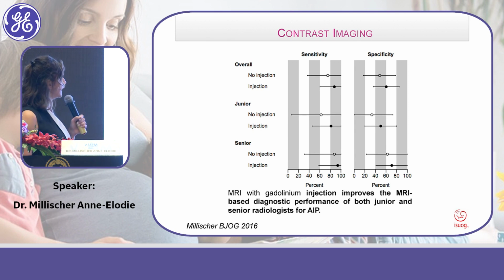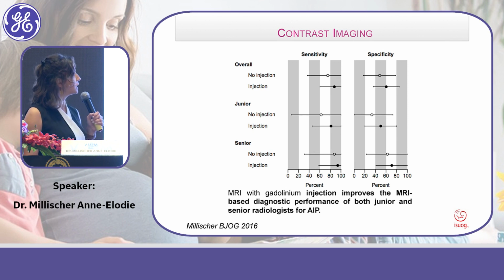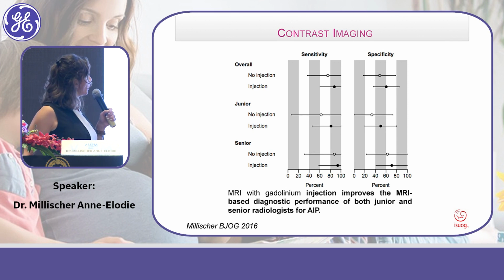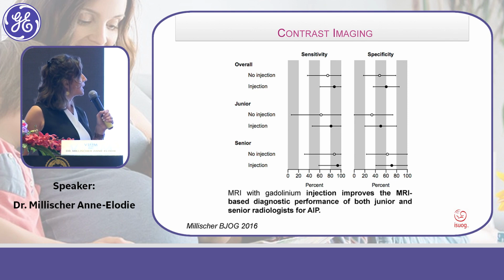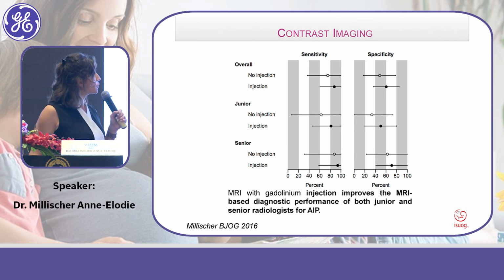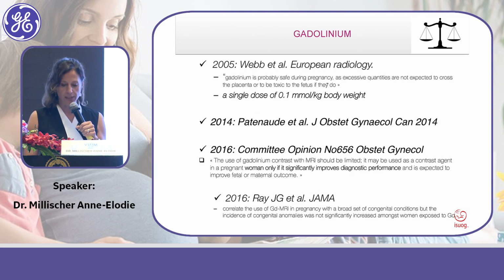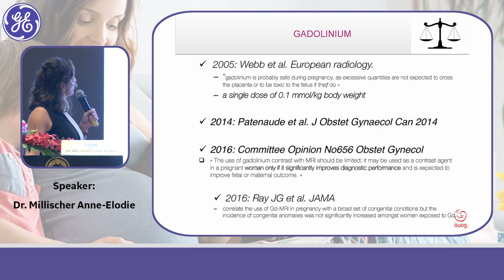And we demonstrated that for junior radiologists, with radiologists who are not very experienced in this pathology, the adding of contrast imaging helps them to do a more reliable diagnosis. And it improves also the capacity for the senior radiologist to diagnose placenta accreta with MRI.